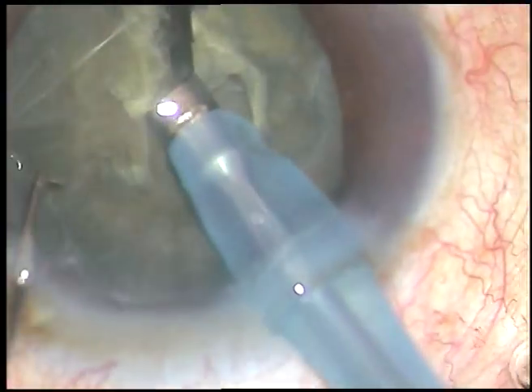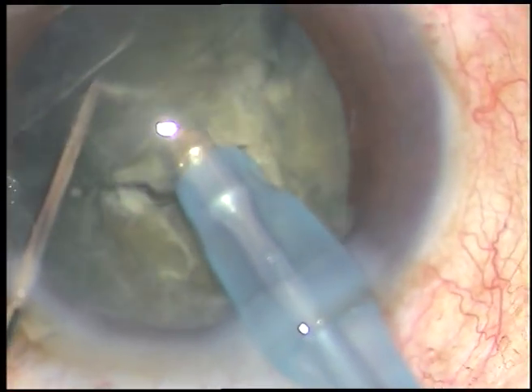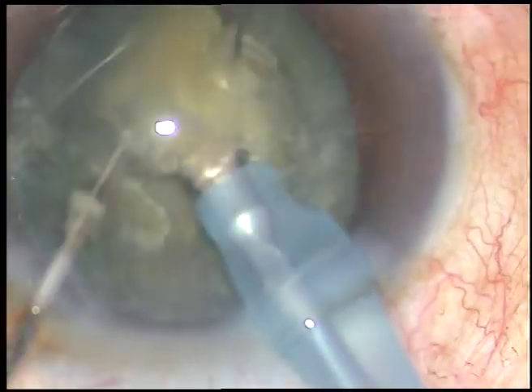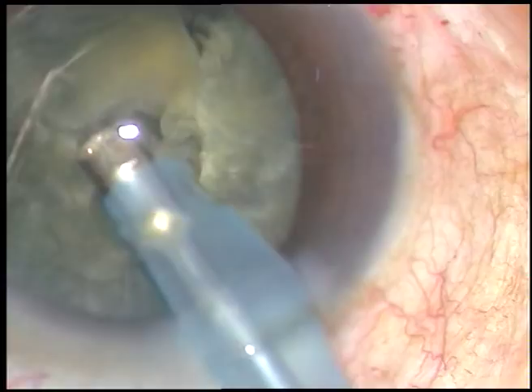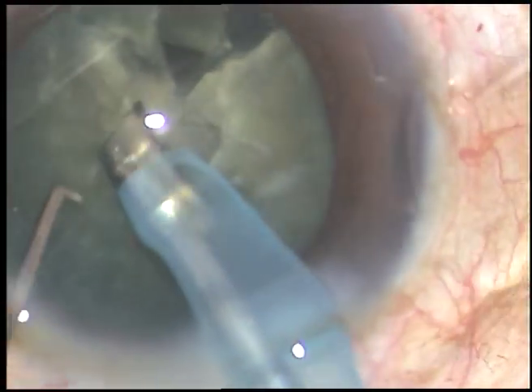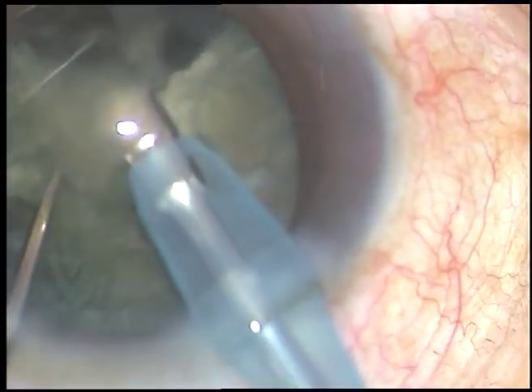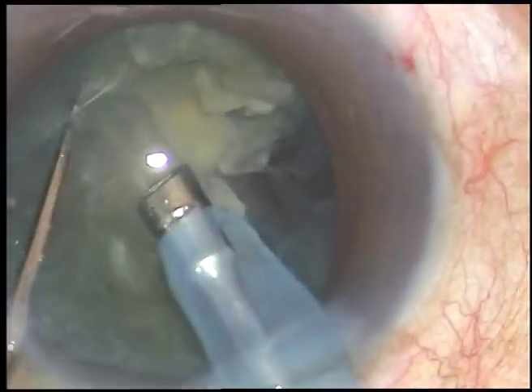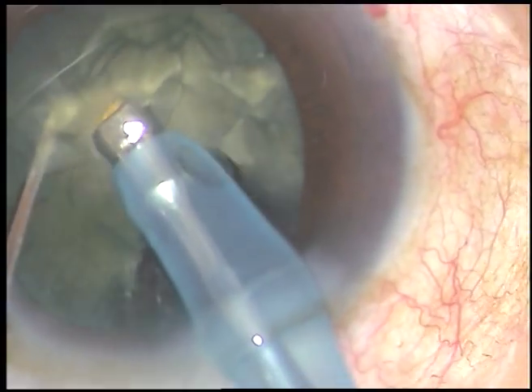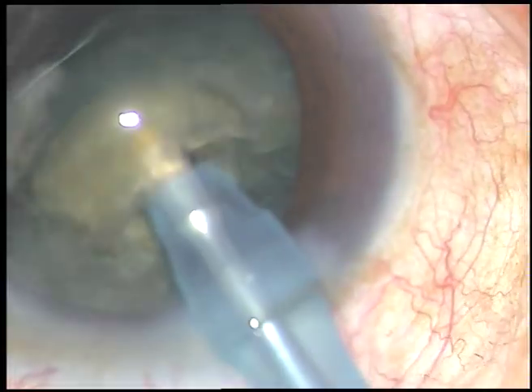This is direct chop. Impale the nucleus and chop it. The free nuclear fragments are emulsified and removed. This is a very brittle nucleus.